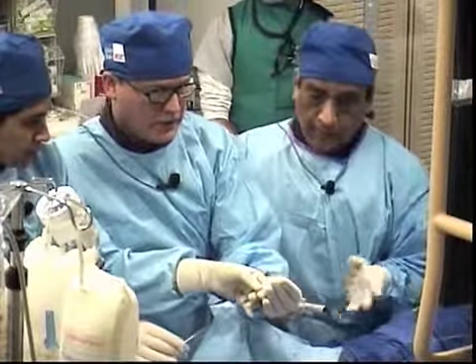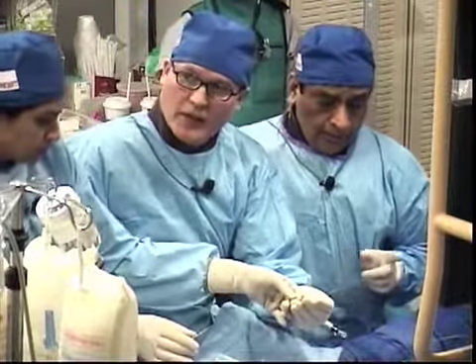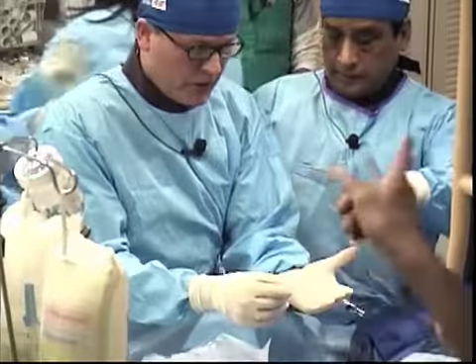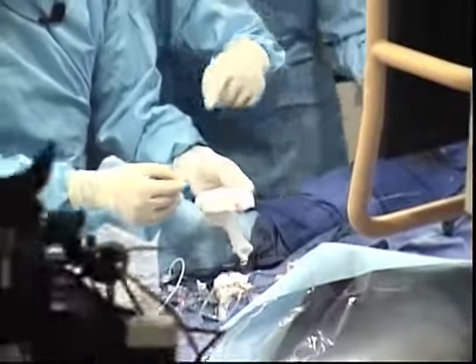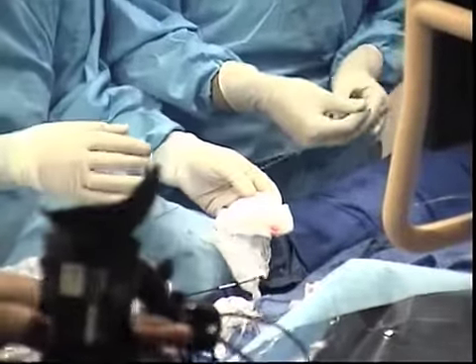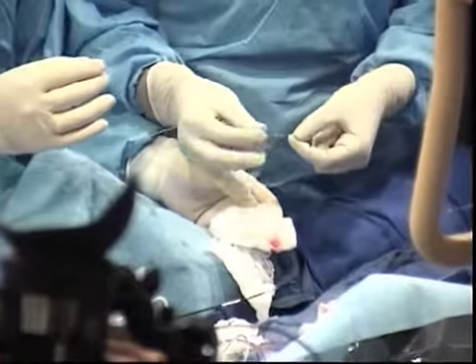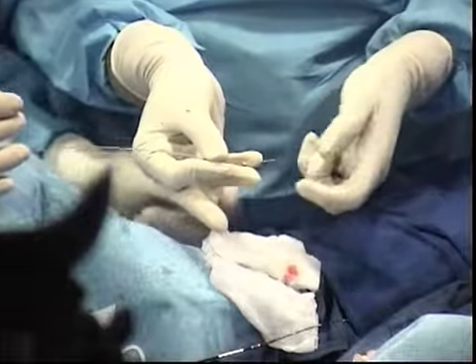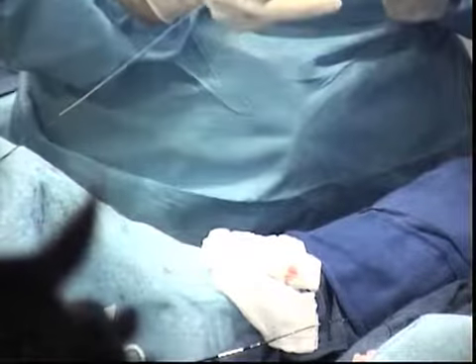What we will do in those cases is very simple: after doing a rotablation, show the laser light. You can show the laser light here. Bring the camera here, showing our finger movements. What we need to do in this case, after rotablation, is dilate with the balloon. If we cannot crack it, then upgrade the burr. And you want to show?